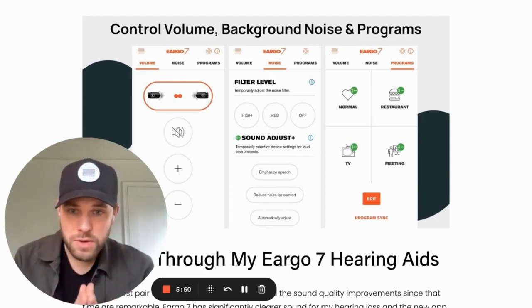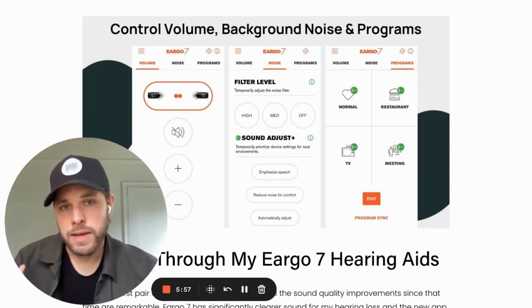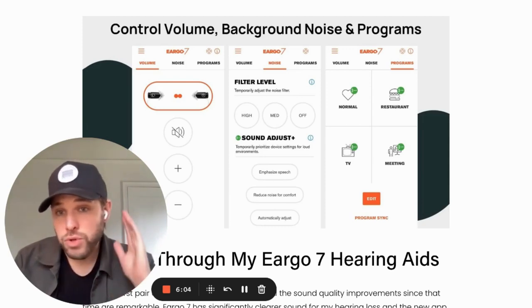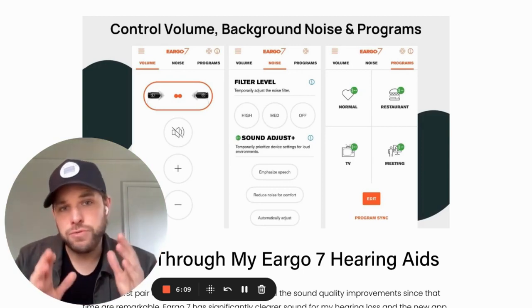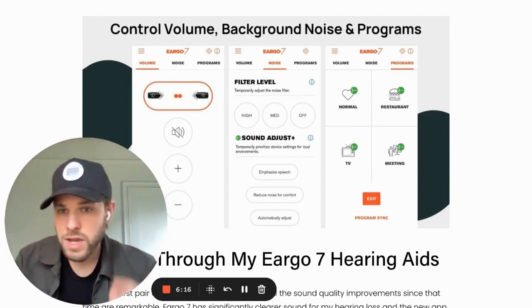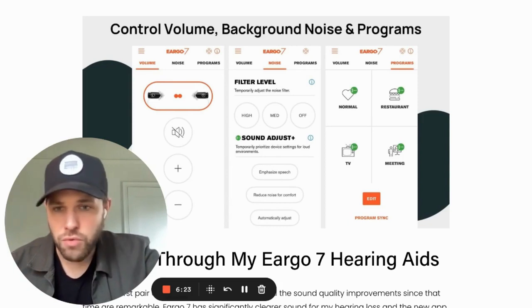These customization options are one of the big updates in Eargo 7 — they didn't exist in previous generations. The last setting is the program setting. You can access this through the app or by double-tapping your ear with the product inside, which changes you from normal to restaurant, to TV, to meeting. One note: you have to do that for each side separately, as the hearing aids don't talk to each other.